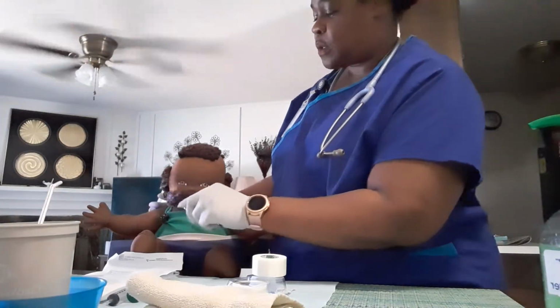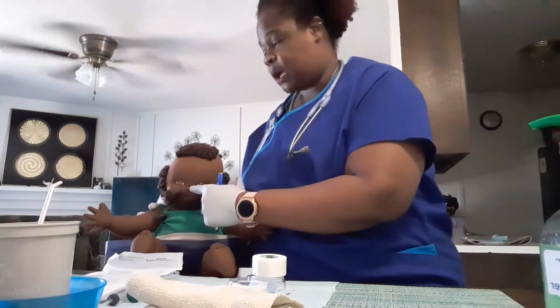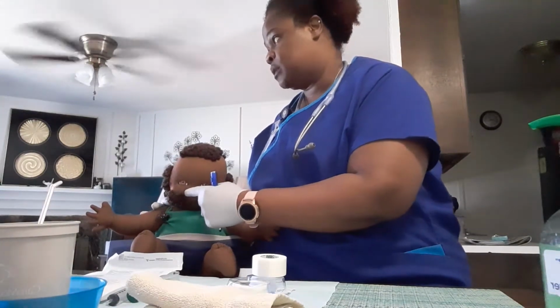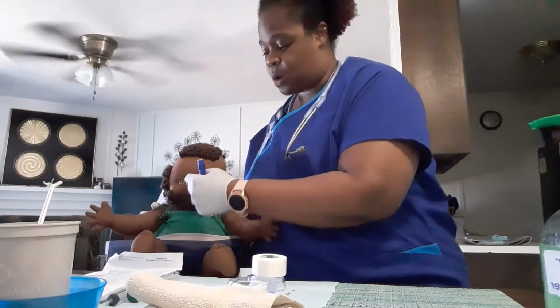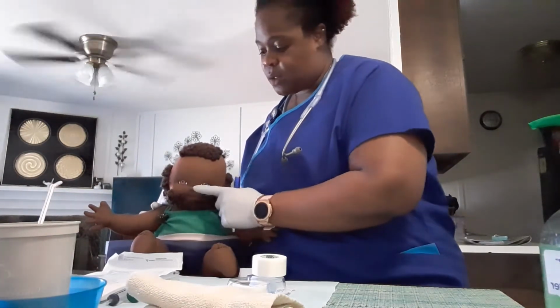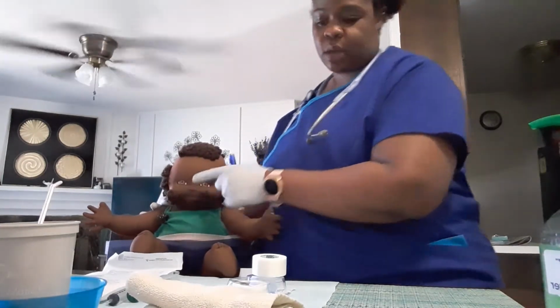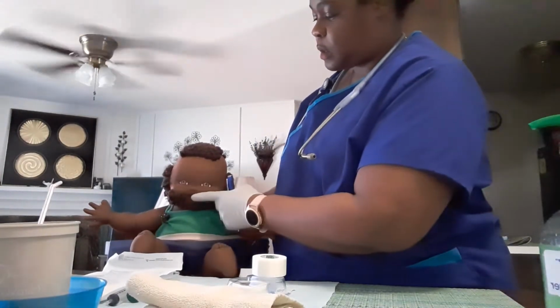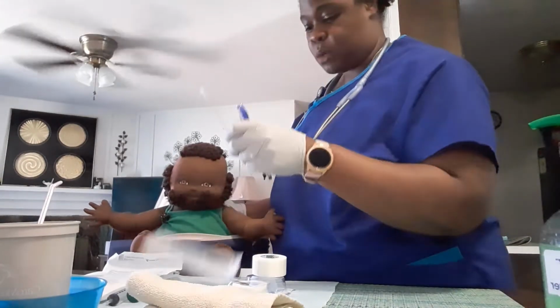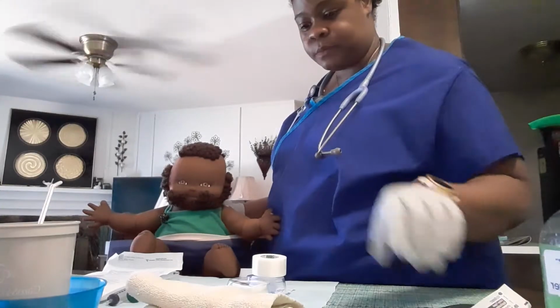I would also want to check for patency of the nares. So I would hold one side, have the patient take a deep breath in and out through the unoccluded side, and do the same thing for the left side. So the right side seems to have more air moving through it better. I will assess for gag reflex with my wooden cotton tip.